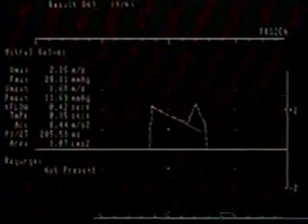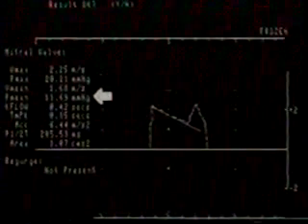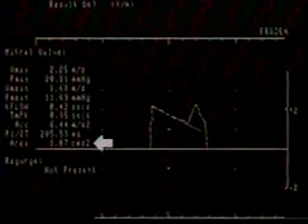Measurements of mitral gradients and mitral valve area have been greatly simplified by software packages that are available on many echo instruments. This patient has mitral stenosis. The continuous wave Doppler spectrum has been traced, and the deceleration slope has been identified. Using this information, the instrument has calculated the maximum pressure gradient, 20 millimeters of mercury, the mean diastolic gradient, 12 millimeters of mercury, the pressure half-time, 206 milliseconds, and the mitral valve area, 1.07 centimeters squared.